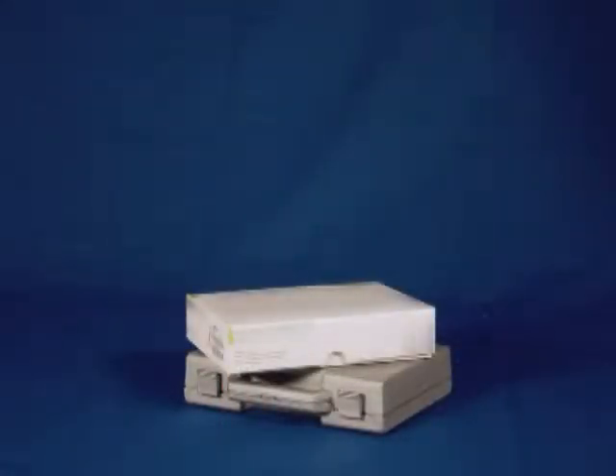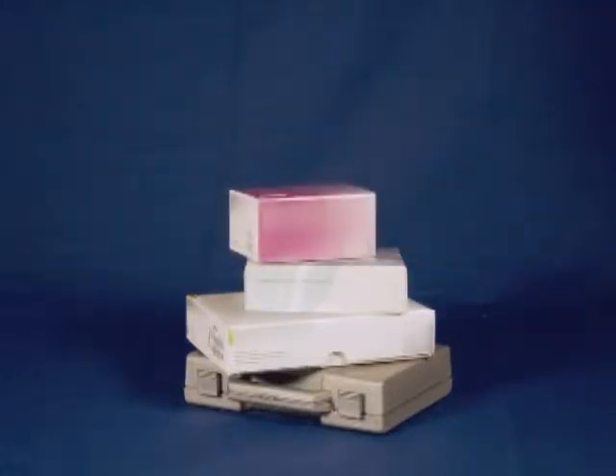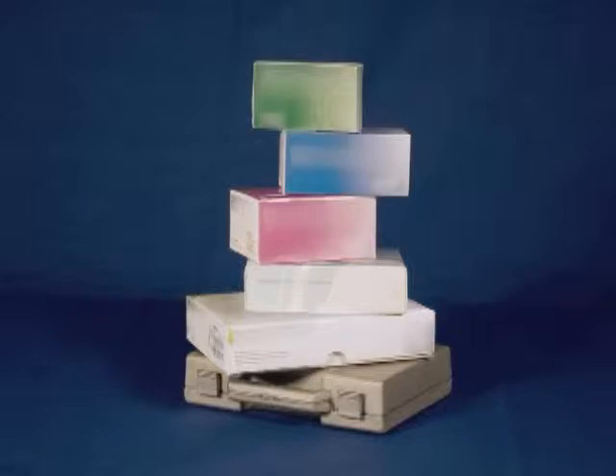It seems like every office is flooded with a confusing array of cements, each designed for a specific technique or type of restoration. In order to practice, we must have a cement for crowns, one for inlays and onlays, another for posts and cores, another for metals, and one special one for those tricky low-retentive preps, and certainly another for my favorite — veneers. Each one has its own technique sensitivities and shelf life. It's a nightmare.